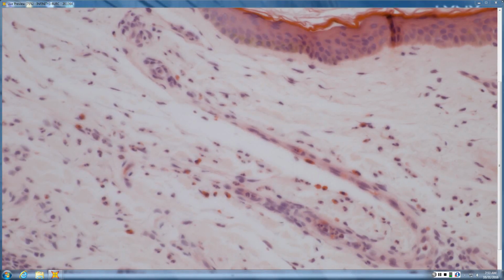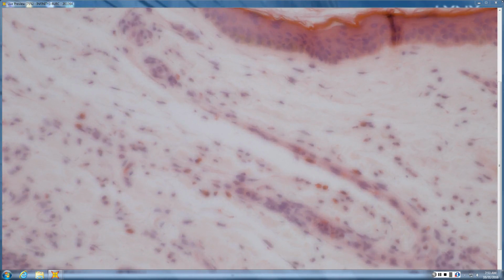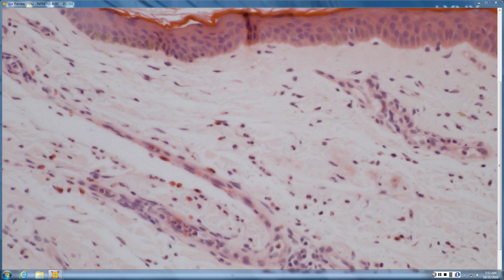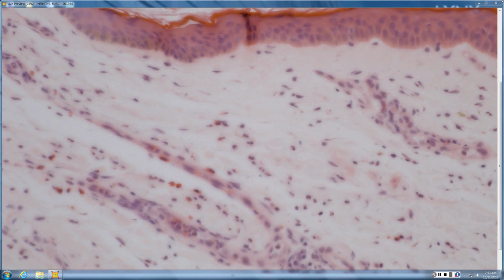Do you see any leukocytoclasis? I do not. So no karyorrhexis, no nuclear dust, no leukocytoclasis. That's all the same thing. Those are synonyms, right? Yep. So it looks like urticaria, right? Early urticaria, just neutrophils packing the vessel. Later urticaria, the neutrophils make their way out, but there's no karyorrhexis. Even later, EOs join, but still no karyorrhexis, right?